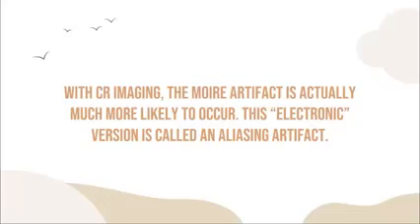Ganyan. Okay? So since we are using different accessories such as grid sa CR pod, okay, tapos napod dito yung reader na napod sila iyahang line pairs per millimeter or iyahang Nyquist frequency or sampling frequency, napod yung sampling frequency ang inyong imaging plate. So pag nagtapal-tapal ni sila, kaning tulo, it is more likely na mag-occur ang inyong aliasing artifact. Okay, so to solve this, special multi-hole grids are available which can also solve this problem.